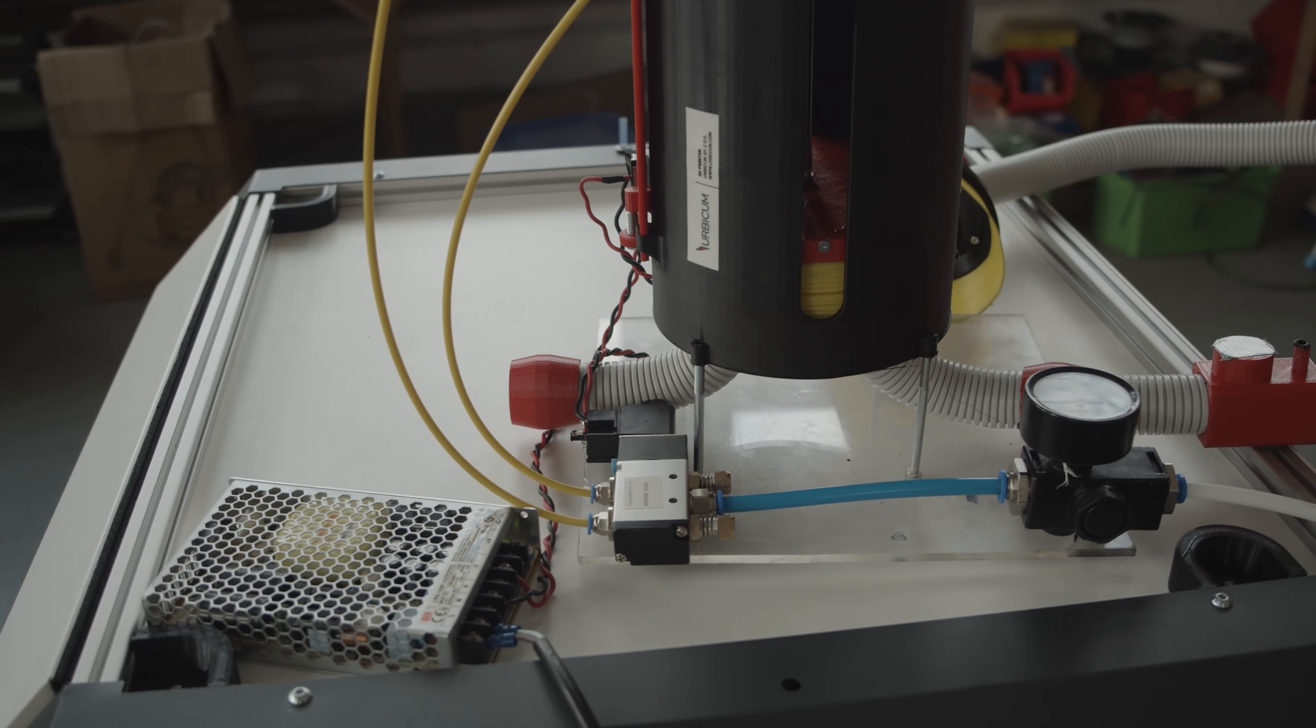That's the main advantage, that's the goal of this project. To support people with ventilators that can be made in any place in the world.